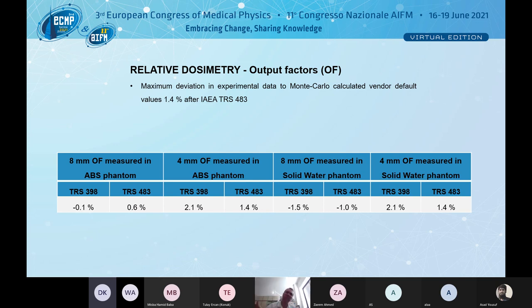You have to follow a very particular procedure step by step, how you scan films, be careful that they don't get damaged, do subtraction of background, and so on. It's a lot of parameters, but we also did measurement on gamma knife with films years ago, and it could be used. I'm just trying to emphasize that sometimes the hospital will not buy you a new detector, but if you have films, you can measure it with films, it's possible.